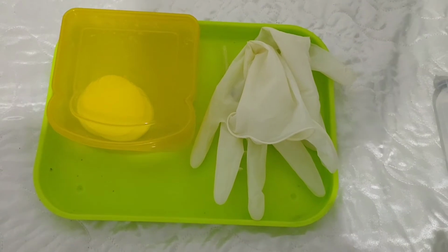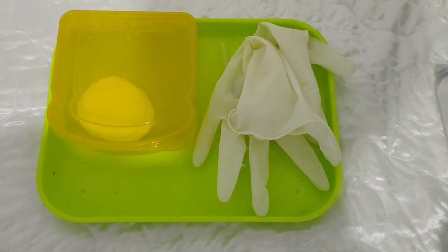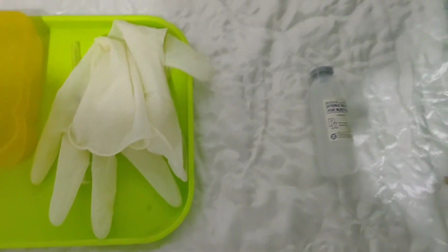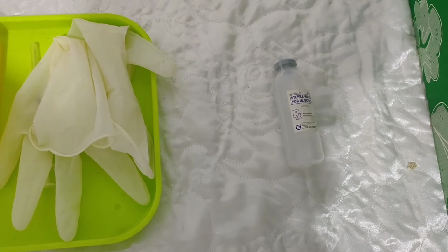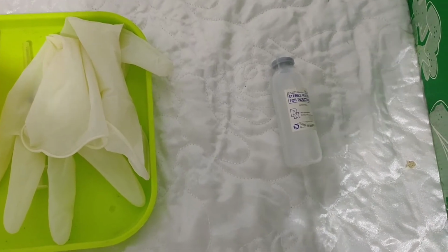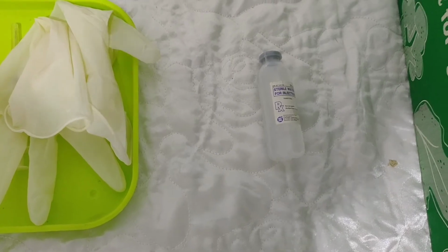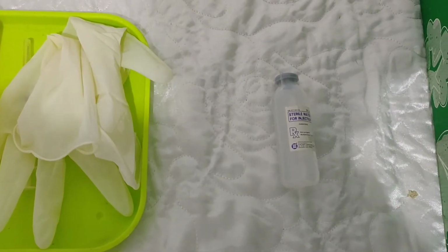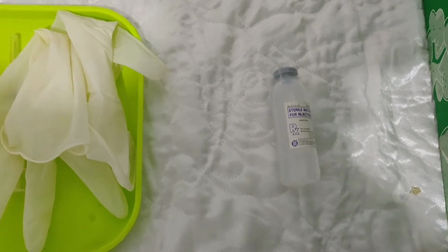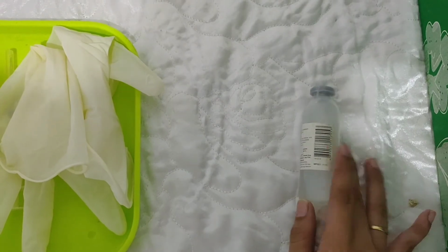Now we need to verify the right medication by reading the label of the medication from the record. We will assume that I read the label. So this is the medication to be administered. Okay, I read it already. Now we will check the label before picking it up. We will assume that this is the medication.